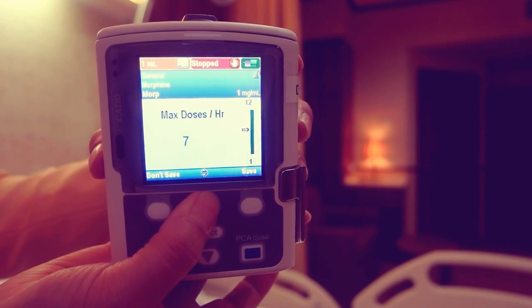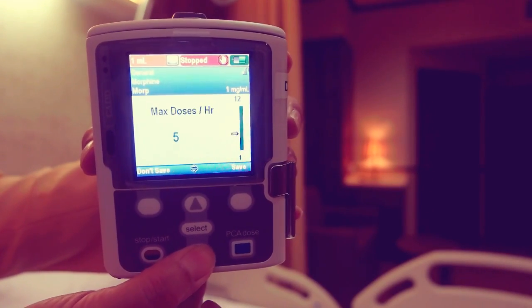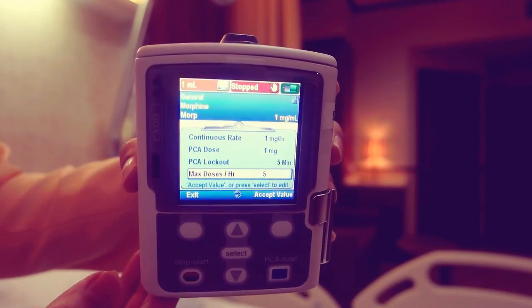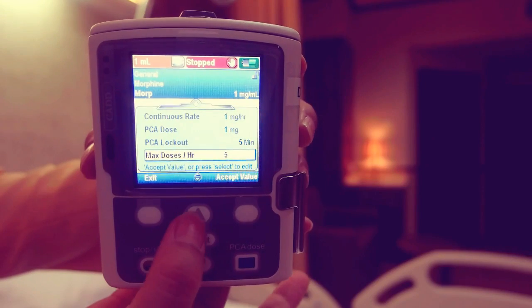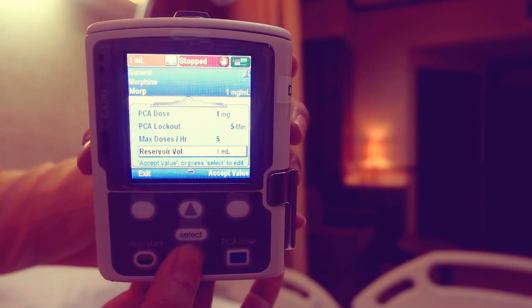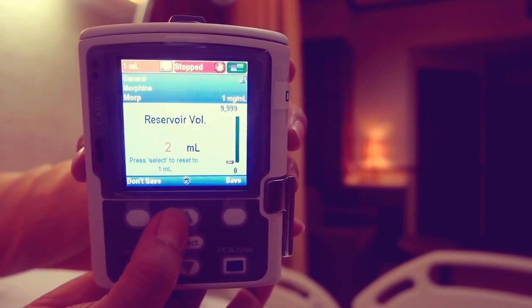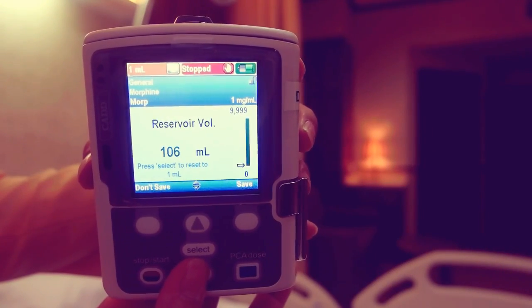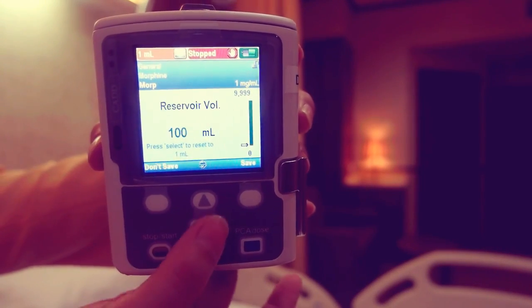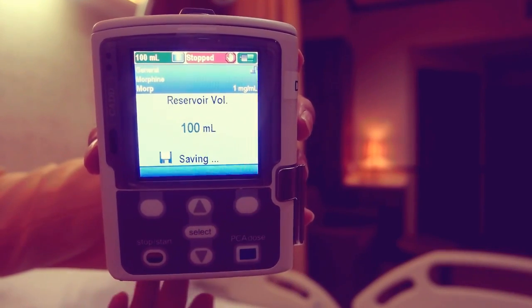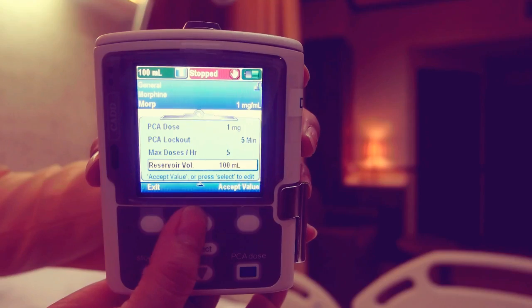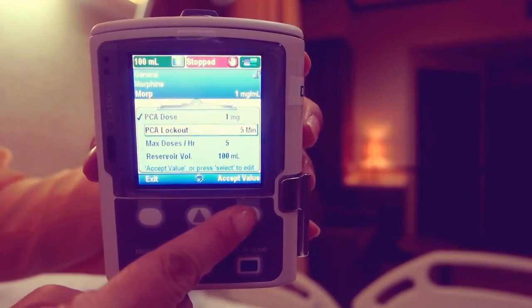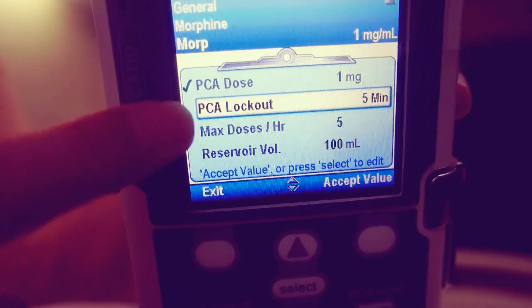You can press the up and down keys to increase or decrease. Then press save after each change. Press accept value for each setting. A check mark appears next to each patient specific parameter you have accepted.